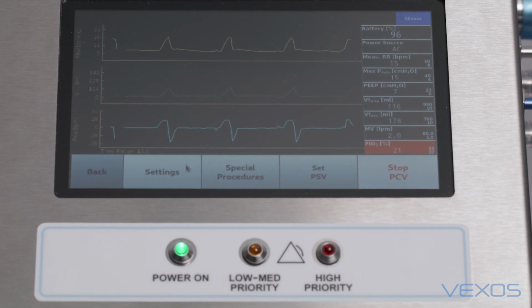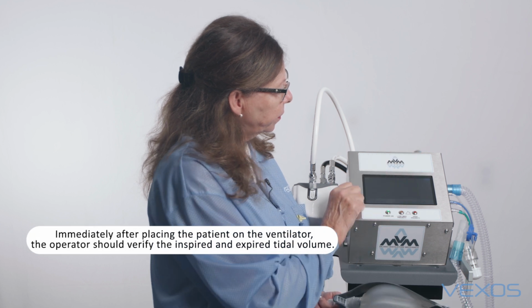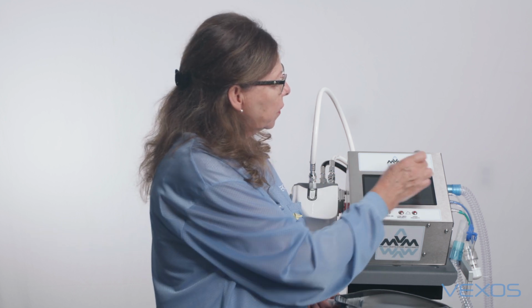And the flow over time is showing that there is flow on inspiration, and we have an expiratory flow as well. There may be some outstanding alarms that need to be reset, just the switch over between on and off in essence. And again, our patient now is being very well ventilated.